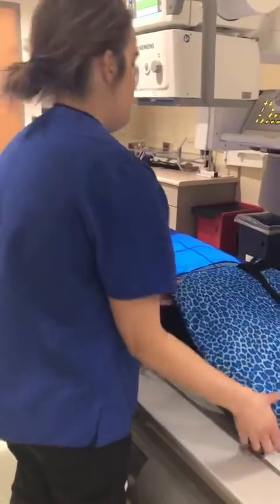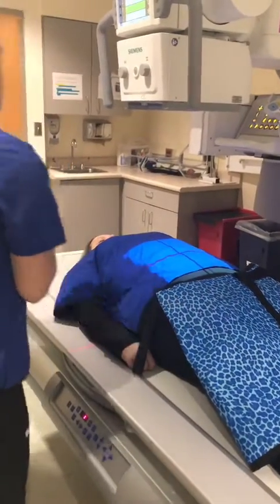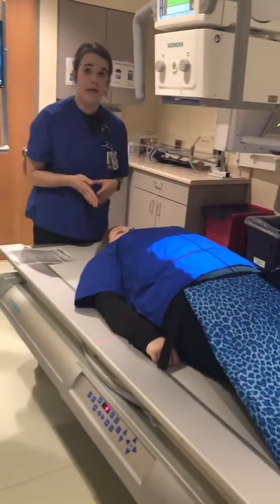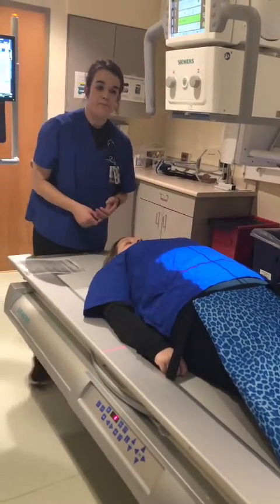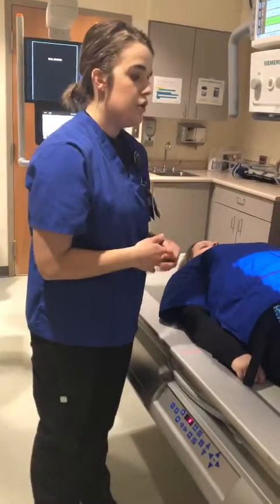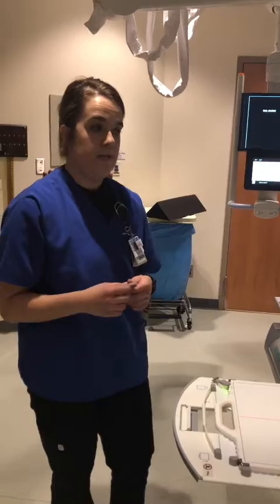If you end up moving the patient, you might want to move the shield down if it's in the way. Also, make sure that you are centered to the midline of the patient's body, so the mid-sagittal plane. It looks like I'm pretty centered right there. Once again, I have a 14x17. I have the patient centered where they need to be, and I have them positioned the way I want them.